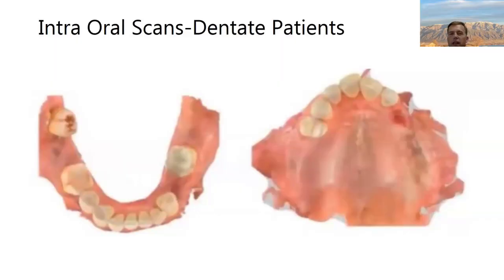We need intraoral scans. So for your dentate patients, you want to make sure that you take a scan that's big enough for a denture. You guys know that scanning tissue isn't easy. You're like, why do I need all that? The reason is because of file alignment.